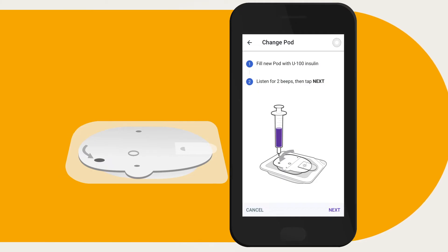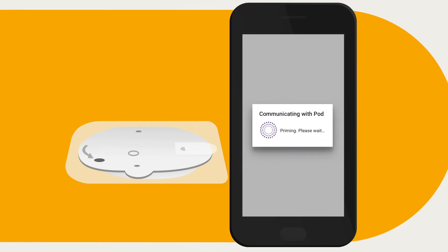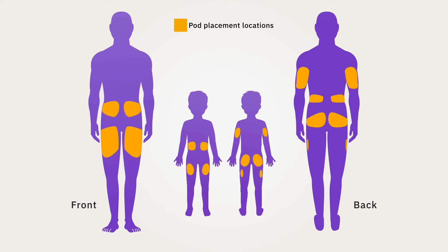After the pod has been filled, place the pod — while still in its tray — next to the device running the Omnipod 5 app so they are touching, then tap 'Next.' The Omnipod 5 app will establish a connection with the pod and automatically perform a series of safety checks and prime the pod. Listen for the tone to indicate that the pod is paired and ready to be applied.